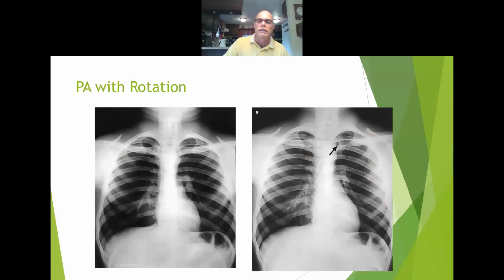And the problem with this one is that we actually have rotation. The reason we have the rotation is that this joint is actually rolled over. So this person has kind of rotated, got his right side rotated and causing the left to be pulled away. The right side is rolling over onto the spine. Hope everybody understands that. Okay, and I think we're going to get into our lateral.